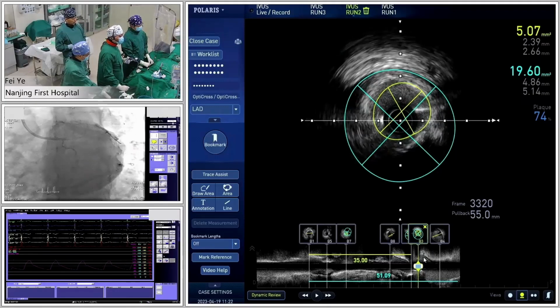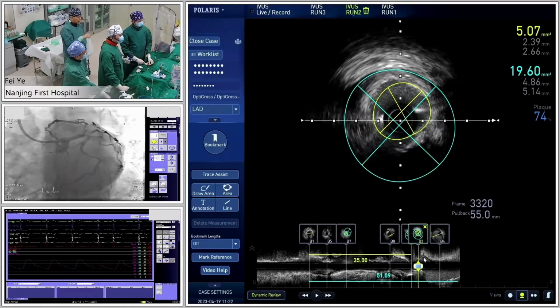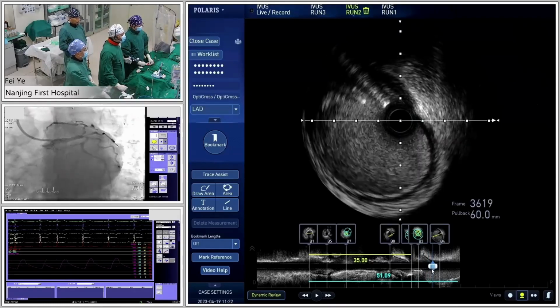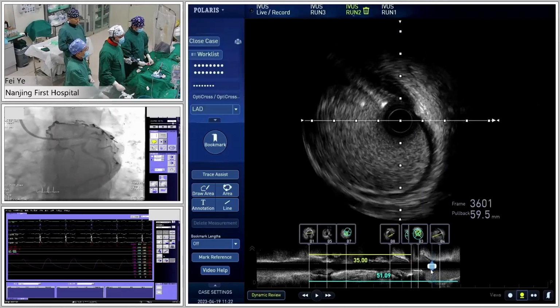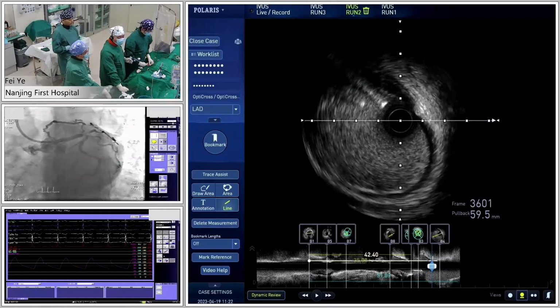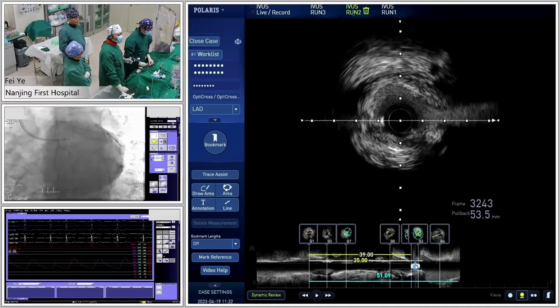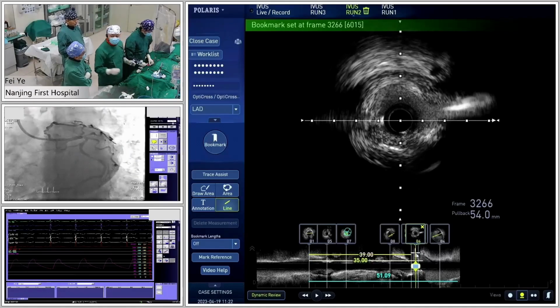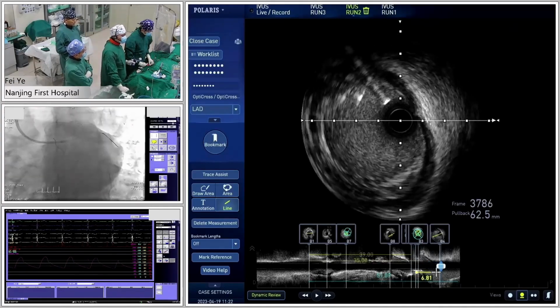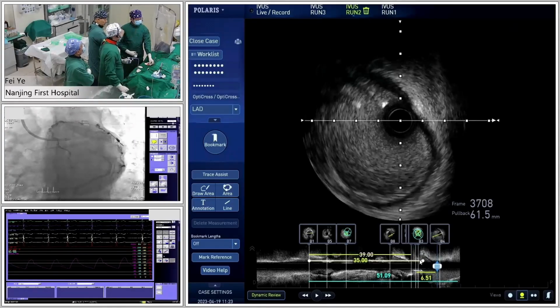So another choice could be to put your stent with the landing zone just in the middle portion. Sure. So Pandal, can you measure the length from the distal left main to the middle part? From the proximal POC area to the middle left main, it's just 6 millimeters. So angiographically, I think you can put the stent just beyond the distal POC area.